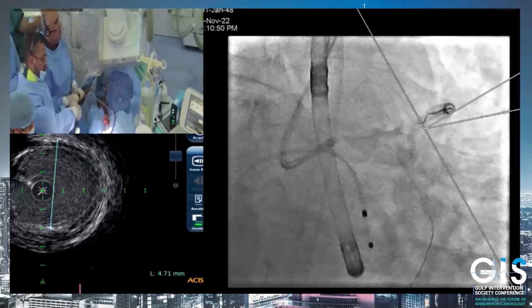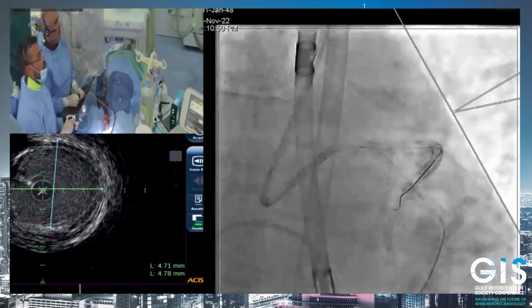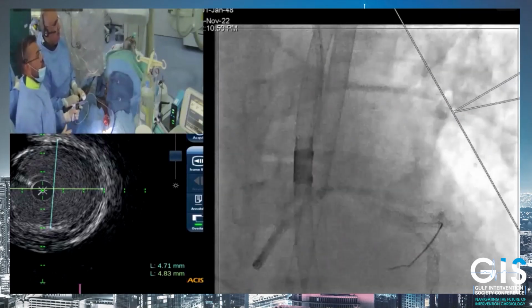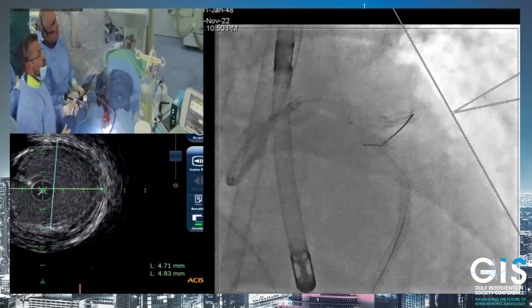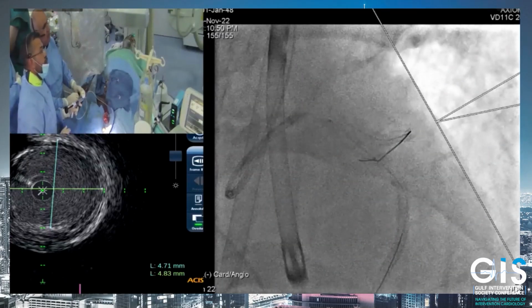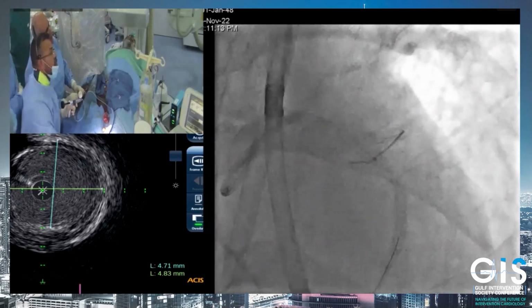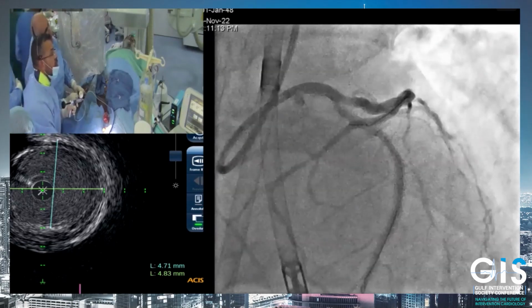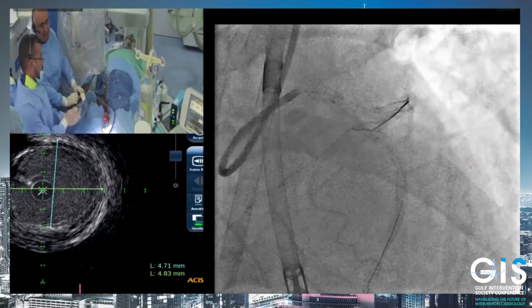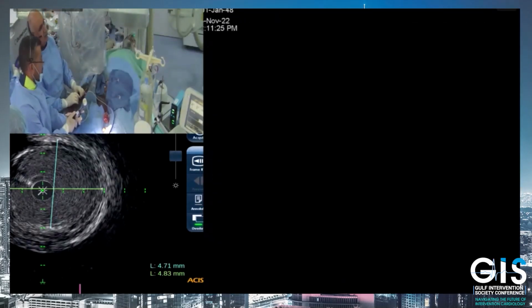So this is a non-compliant balloon. PA cranial, please. We have to post-dilate that part to have really our stent deliverability, not to have a lot of chance. See, it went very nicely in actually. Small test, please. So the left main proximal reference segment, as you can appreciate here, is just approaching 5. It's 4.7 by 4.8. 10, please. This is a 20 millimeter balloon length. 30. Okay. 30.